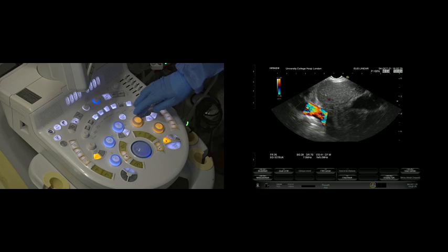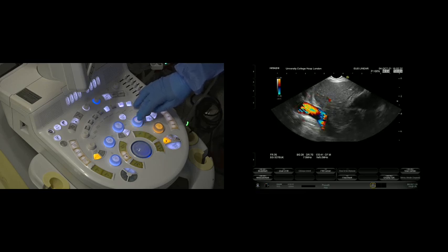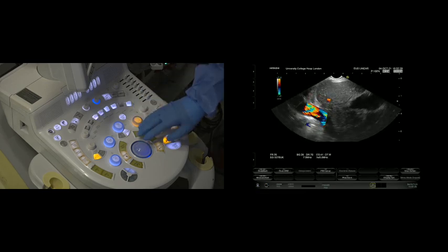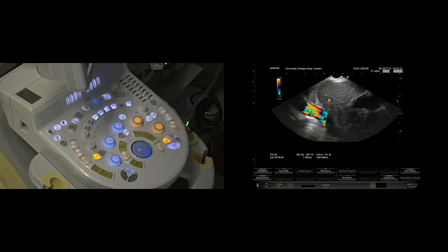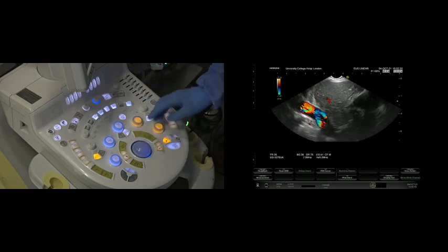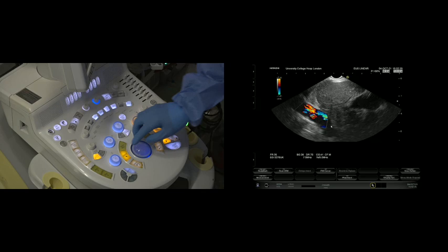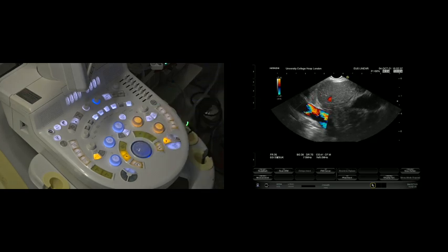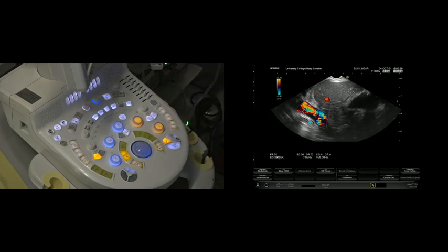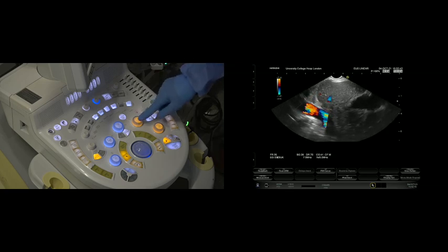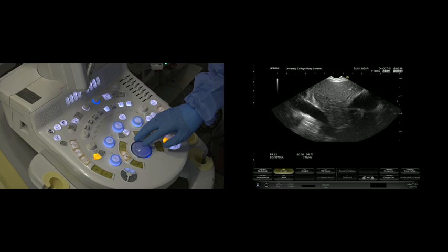That's it. Off with the Doppler. You'll see what Doppler does to the image quality because the machine is working extra hard—our frame rate has dropped to 35. So it's not a good idea to do your routine diagnostic work with Doppler on for that reason. As soon as we drop the Doppler, this goes back up to 92 on the frame rate.